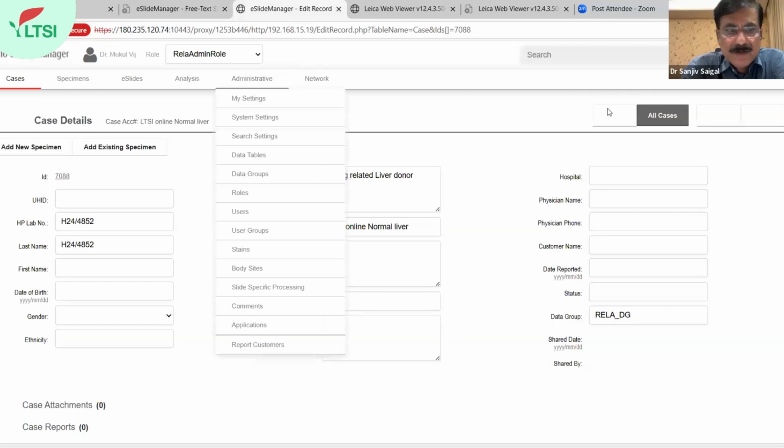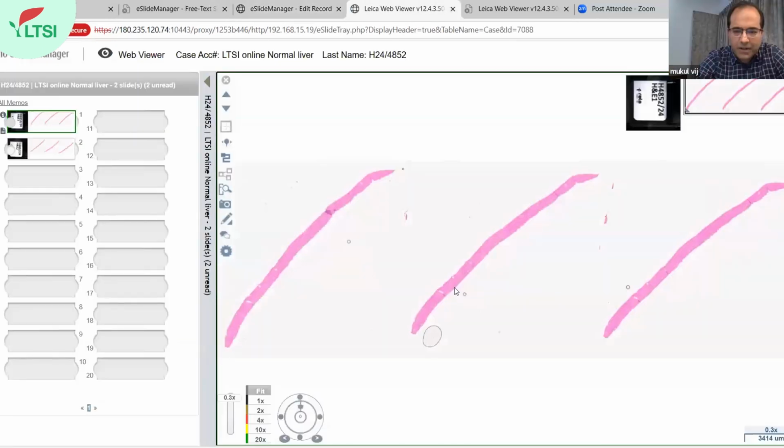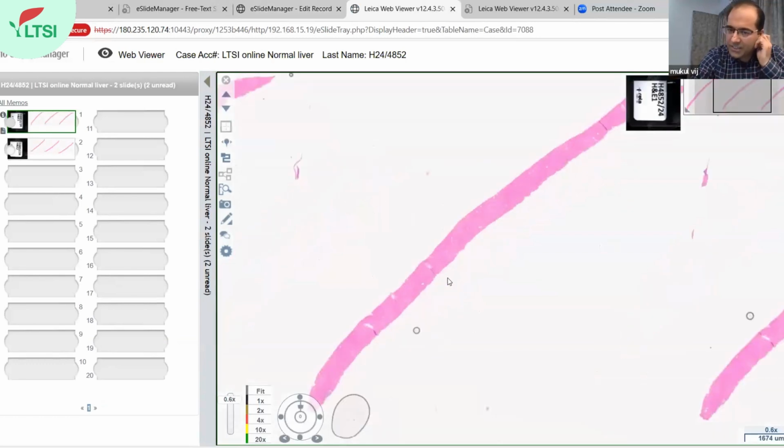Yes, you are audible. Okay, so I thought to show you an explant liver from a pediatric metabolic disease, just to show you the concept of the lobule. In the report you will see that there is a central lobular area and a periportal area, and I wanted to show you the lobule, but somehow I'm not able to open that image in this.